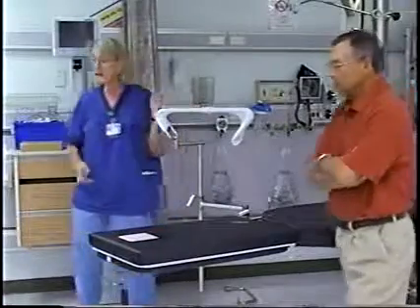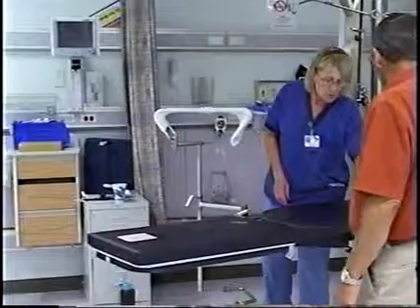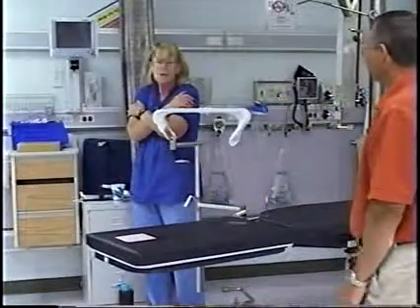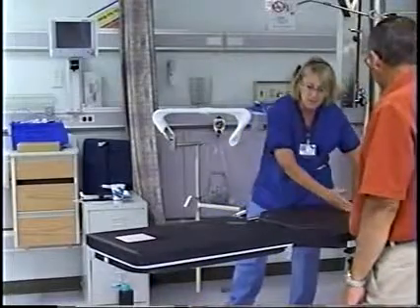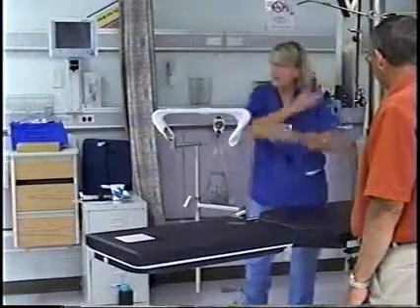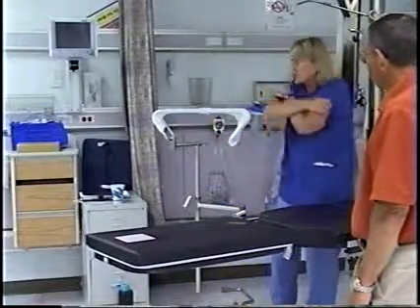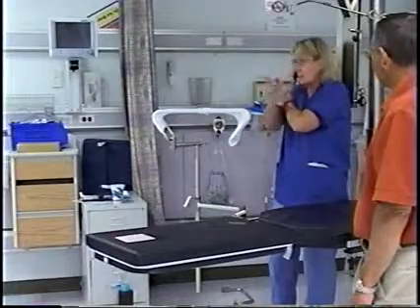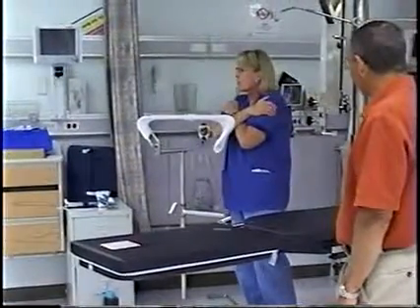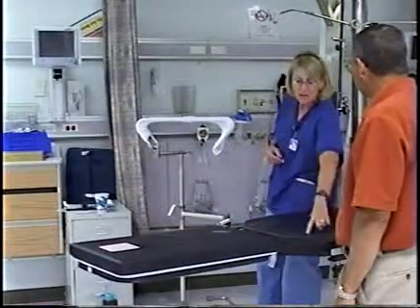Yeah. And we do have this thing right here for arm boards, but a lot of times you'll just see people tuck them up here and wrap around them. That's the reason why we like to put another sheet right here, a real long sheet. That way you can kind of mummy the patient and secure the sheet right here on their elbows, and then the scrub nurse will give you two towel clips and you can really secure the arms up. You really have to have them high so the elbows don't dip down into the view of the C-arm view.